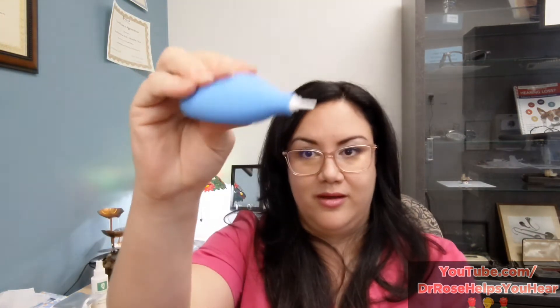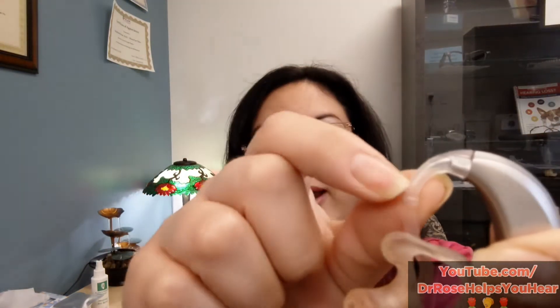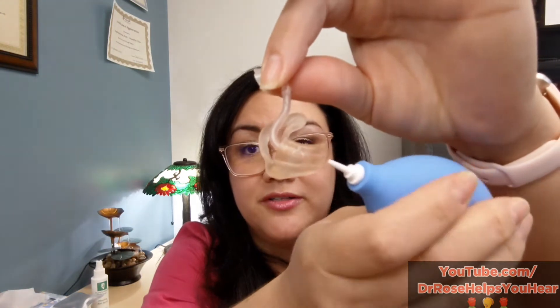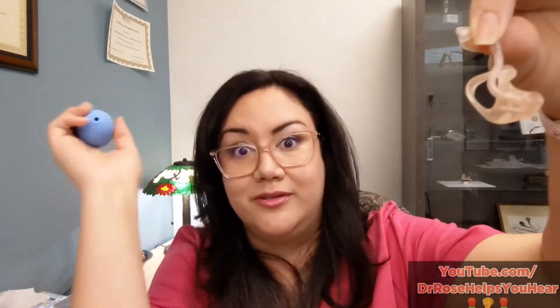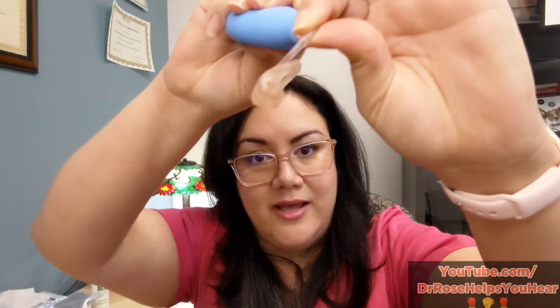I have two solutions for moisture in the tubing. The first is a tube blower. For a hook with no filter — meaning no little white, green, or gray thing inside, just a clear hook — the easiest way is to untwist the hook, take the tube blower, and start at the top of the hook. Don't start from the ear mold end, because then you'd be blowing wax up into the tube. Start at the top and give it about 10 to 20 squeezes.